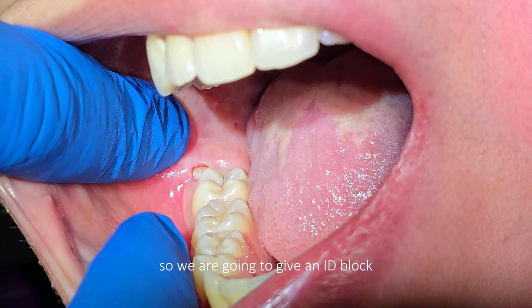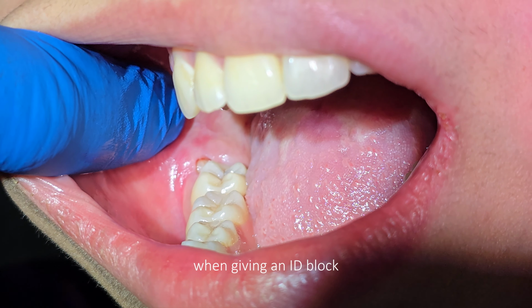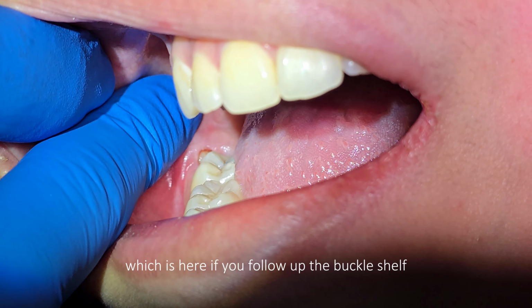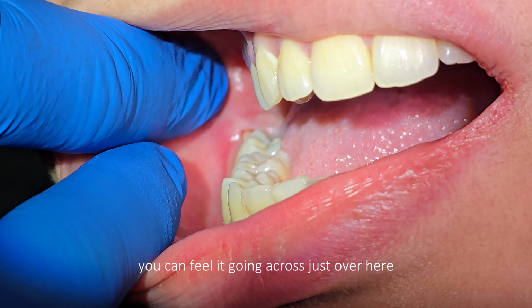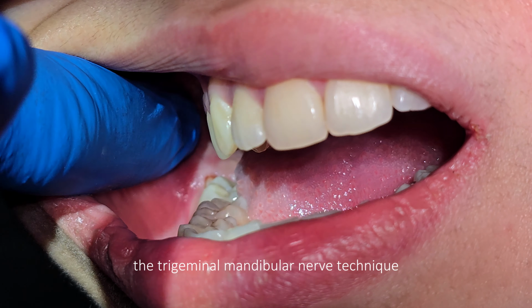So we are going to give an ID block to anaesthetize this lower right 8. When giving an ID block, what we're hoping to do is to palpate the external oblique ridge, which is here. If you follow up the buccal shelf, you can then feel it going across just over here. And we're aiming to deposit our local anaesthetic in the pterygomandibular raphe.